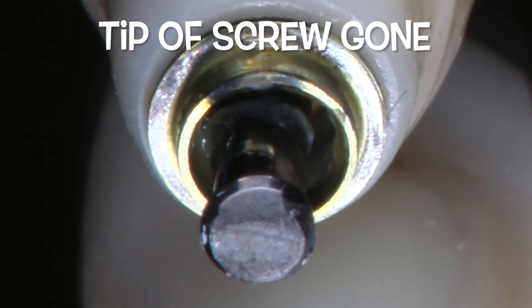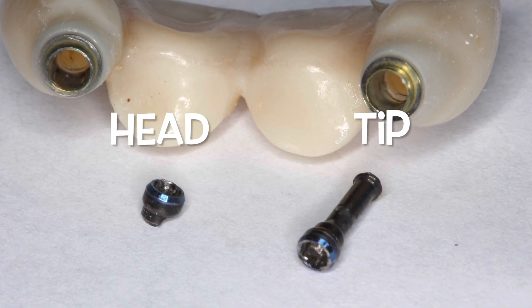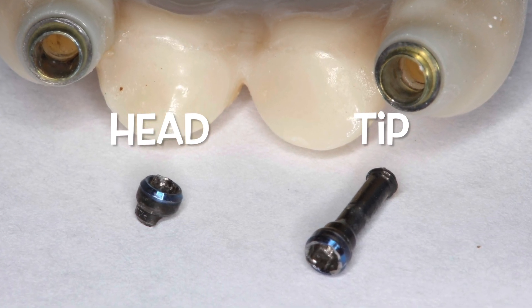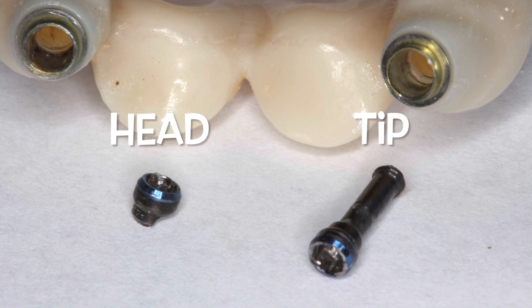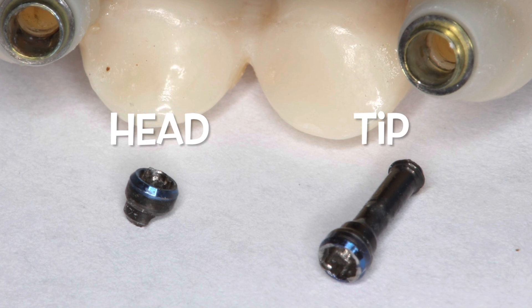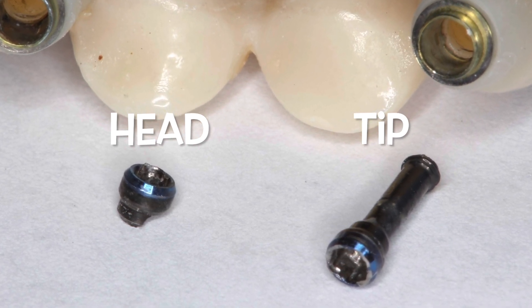Looking at the patient's occlusion, she doesn't have any back teeth in the upper left quadrant, so she needs to get some posterior teeth repaired. There's the head of the screw that broke, and there's the other side that has the tip of the screw that broke. We're going to have to fix this and put two brand new screws in, but the broken screws need to be taken out first — that's the concern.